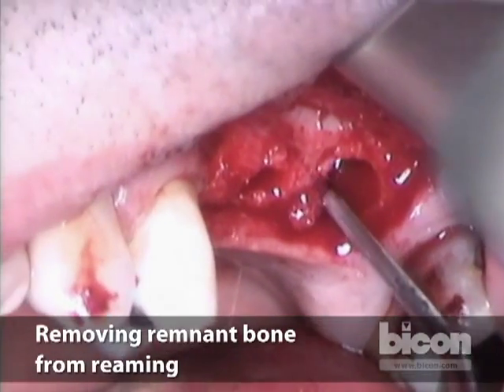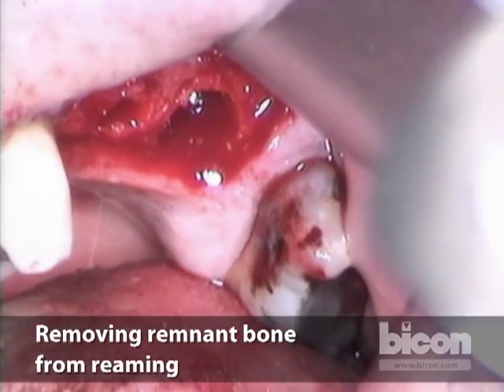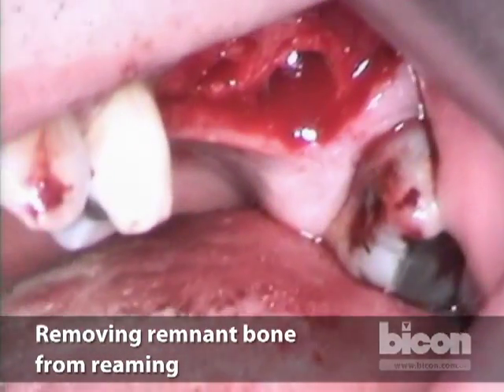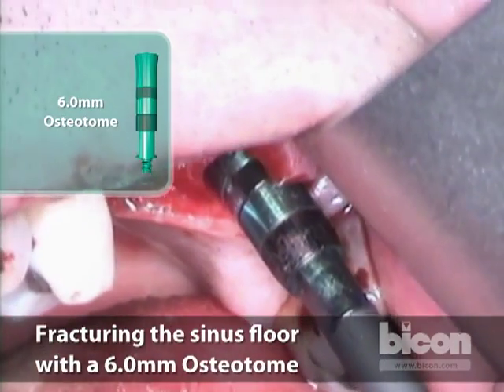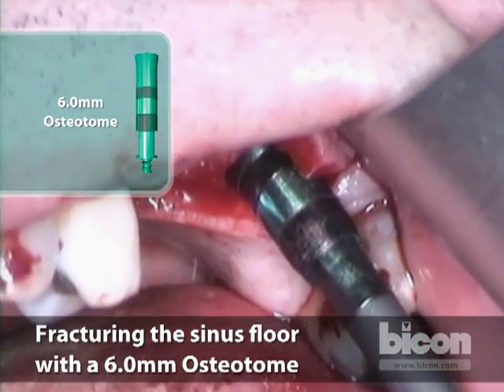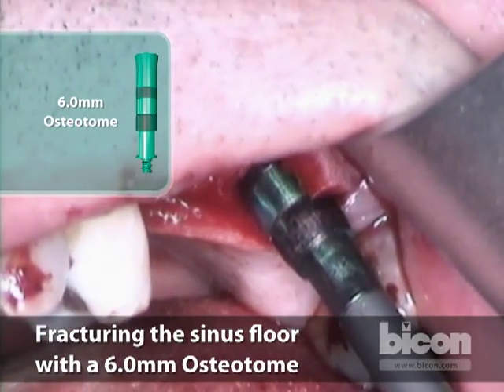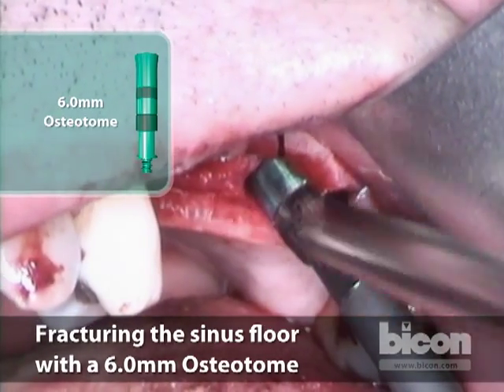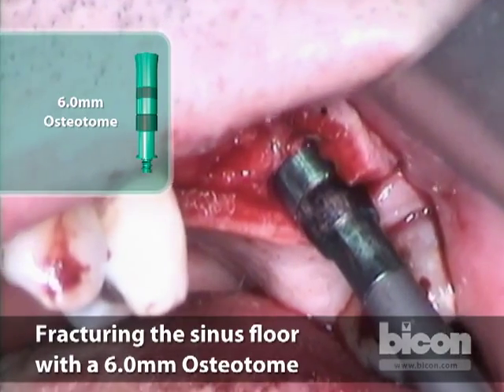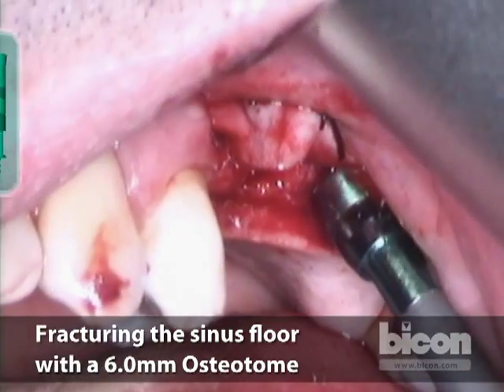I still feel a bony floor. The bone chips will become packed against the floor and start dampening the force, so I'll get those out. I just saw it move right now. I want to move it to just above the top line — that means it's about four millimeters — it's mobilized. Now we will take it out.